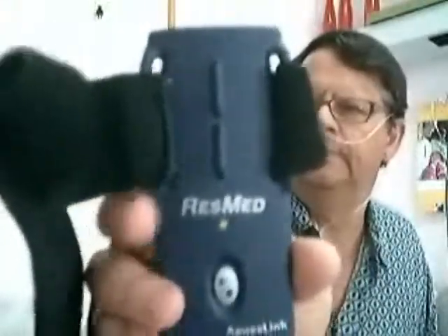Then connect the other side to the ApneaLink — there's only one place you can connect it. Tighten it, not too hard to break it, but tight enough to make sure it fits well. Then hold the ApneaLink in your hand and press the button until the green light goes on. Then it's on.